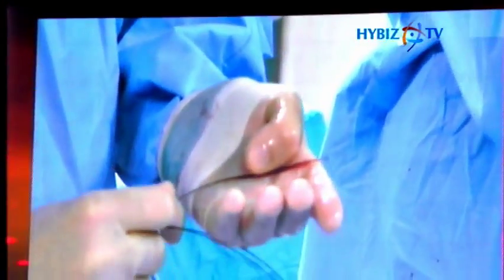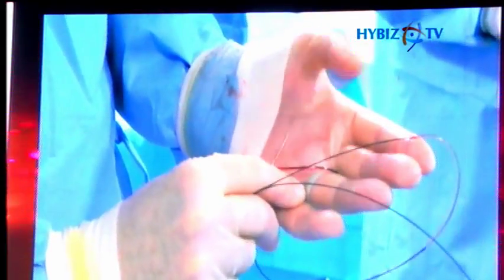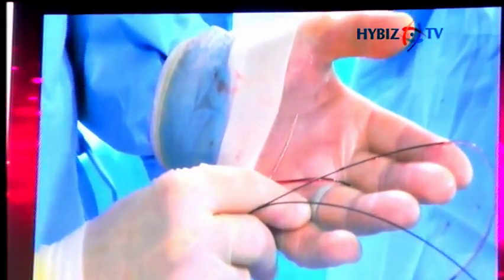It's quite difficult to see, but you can actually see there's the sheath, which we've disconnected away. It's quite difficult to demonstrate, but this actually comes out of the body. There. Yep, we could see the split. Yeah, there you go. So you can see that there. That's the balloon, and that's the sheath that was holding the stent in place.